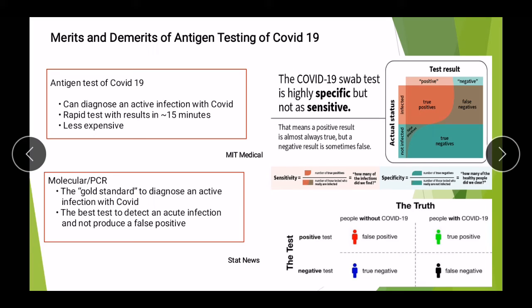There are different companies, like PanBio, which produce these strips. Nowadays it is commercially available, and we can even order it and test from home. Again, it is advisable to do the test where expert medical staff are present. Now I'll be moving on to the demerits.